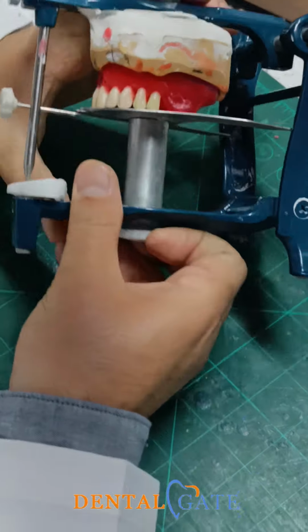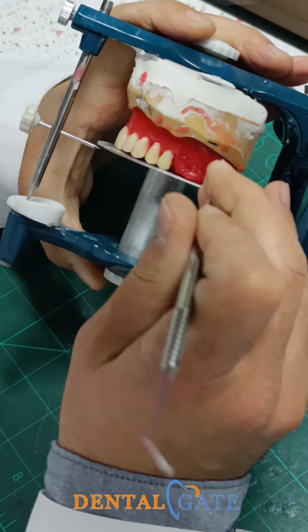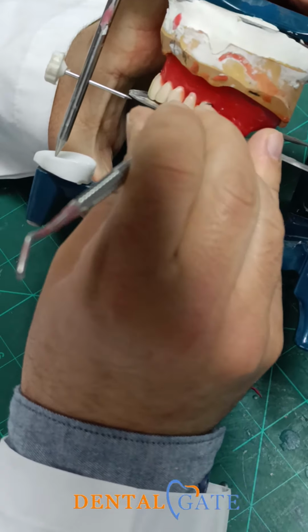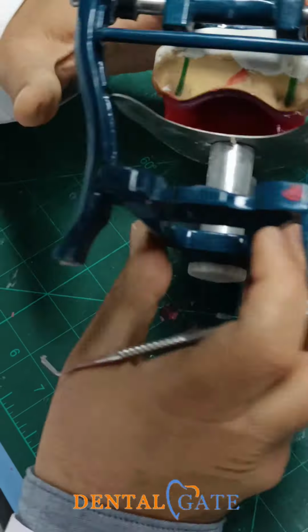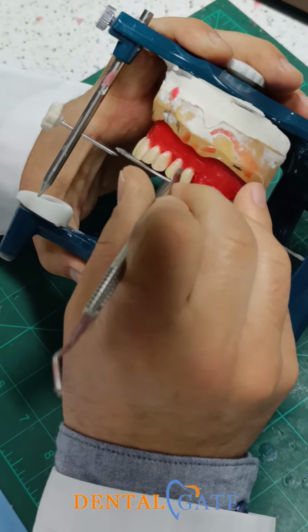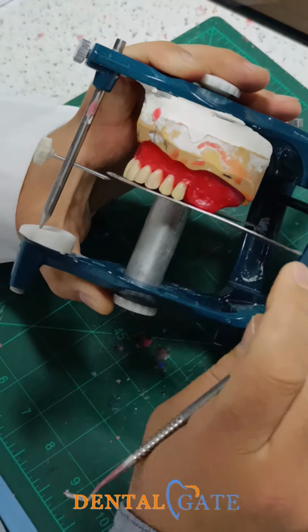So you can see my objective now: both cusps should touch the table. You can make evaluation from the lingual, from the palatal, to be sure both cusps should follow the table.